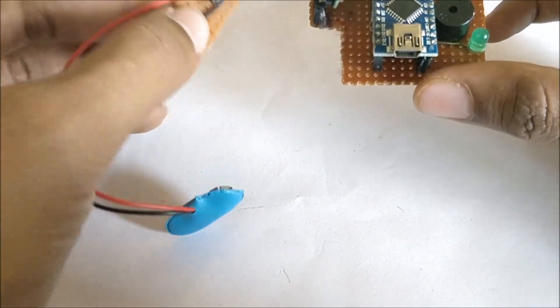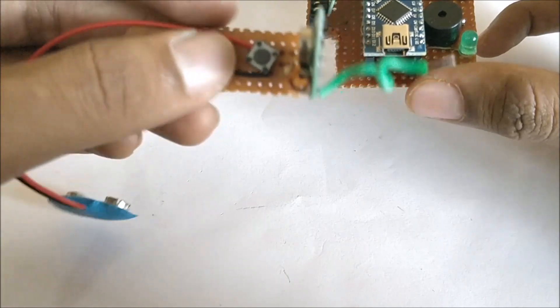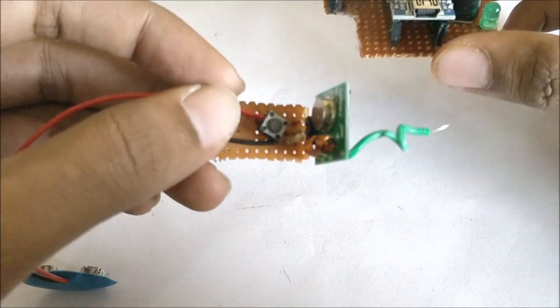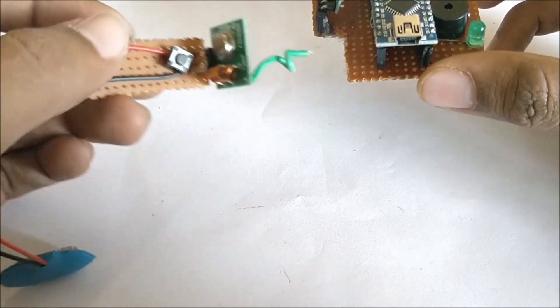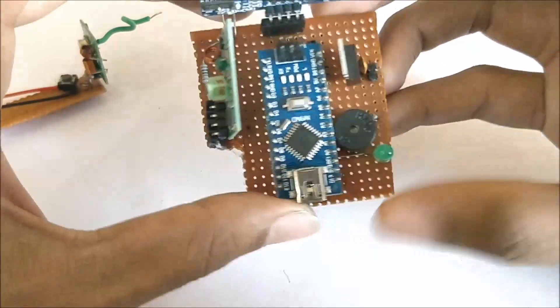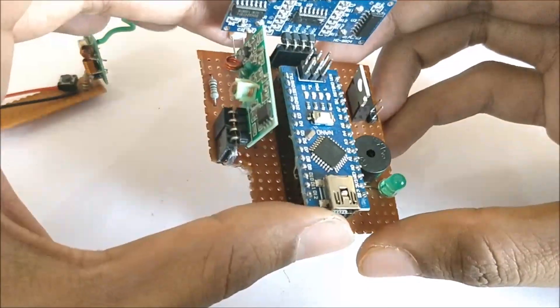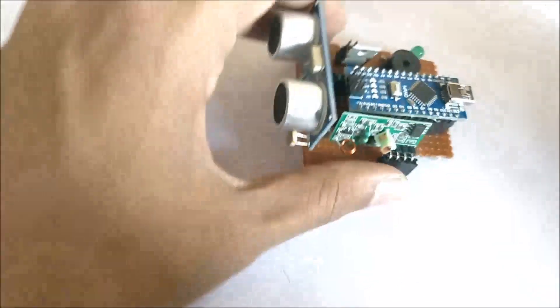As you can see, this transmitter is very small. The blind man can easily carry it in his pocket. If he loses his stick or wants to know where his stick is, he can just press this button and the buzzer will start beeping to guide him to the stick.